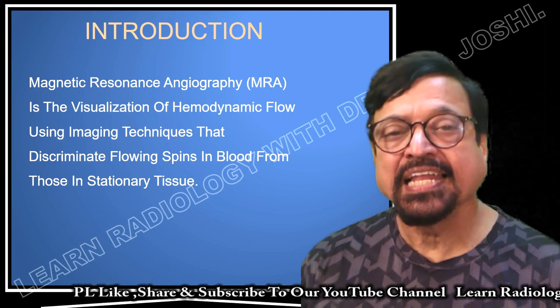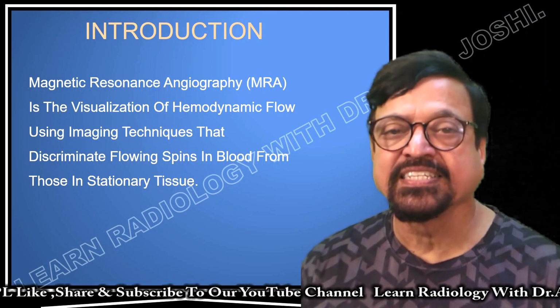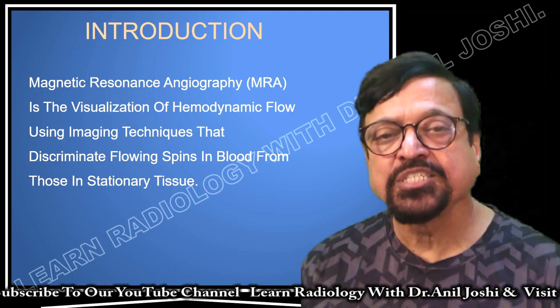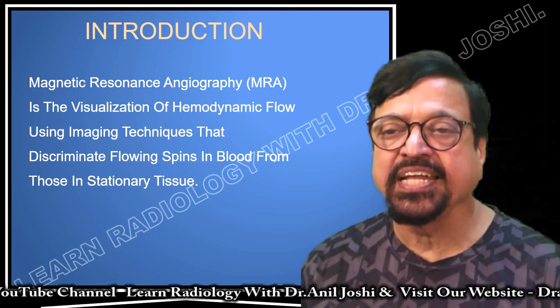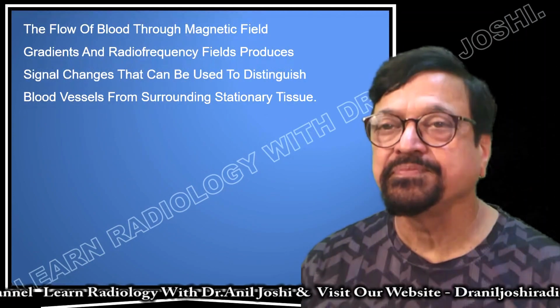If we can image a blood vessel with different flow, arterial and venous can also be imaged. That is the technique MR uses: it images both tissues separately, moving and stationary, and eliminates the stationary tissues. So you get the moving tissues, which are the blood components and blood vessels.